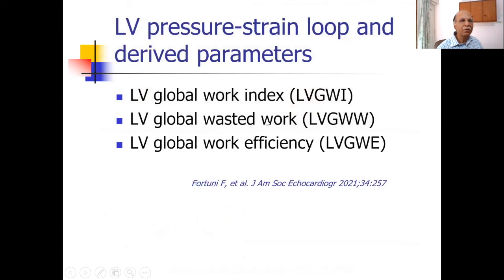Finally, I wish to tell you about the LV pressure strain loop. You might have heard of the pressure volume loop, but the pressure strain loop is pressure plotted against the strain. Based on this, you calculate some parameters. One of them is the LV global work index.